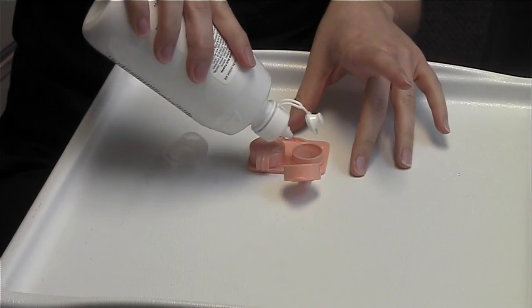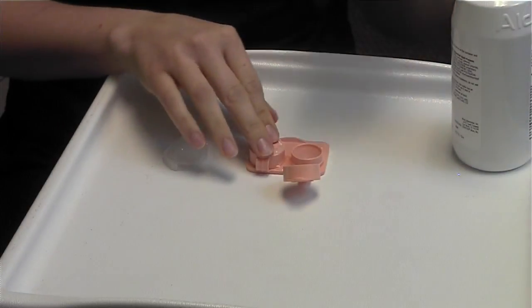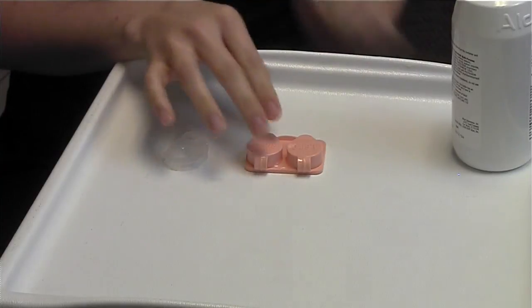You never want to store solution in the case for days at a time. Cover tightly, and that's how you'll clean your soft contact lenses.